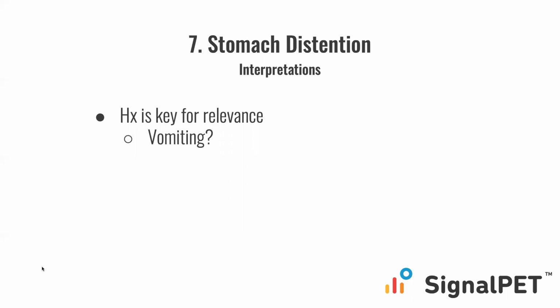When there's gastric distension, especially with a soft tissue density, and there's a history of vomiting, we more commonly think of a foreign body. The dog, typically a dog, can be a cat, the patient is unable to bring up what's in its stomach. It's trying. So I think that's when you worry about who's missing a pair of underwear or such. Otherwise, if it's aerophagic, you look for a reason that the dog, or the patient, is aerophagic.